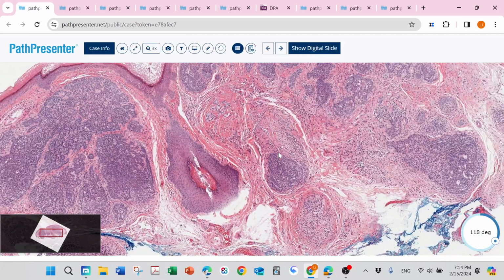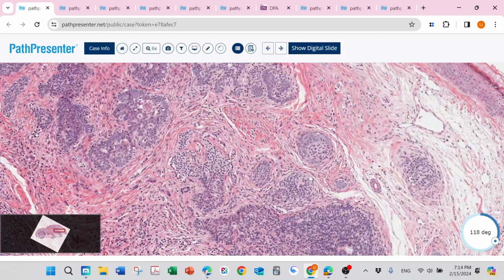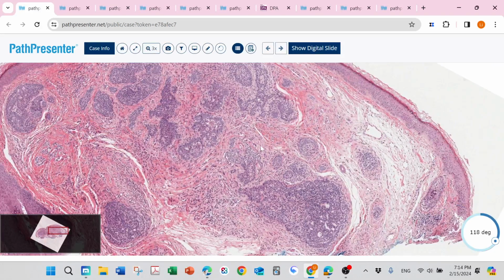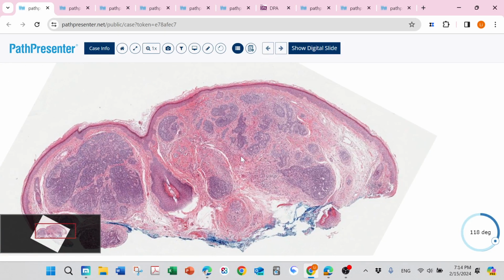Then we want to see our friend, the papillary mesenchymal body. This one is really nice: basaloid cells hugged by these spindle fibroblast-like cells, papillary mesenchymal body. And then remember, we can do CK20 to highlight the passenger Merkel cells.